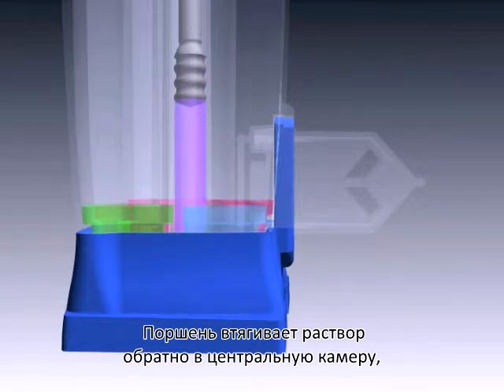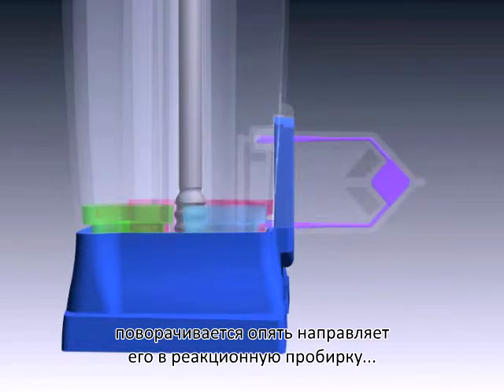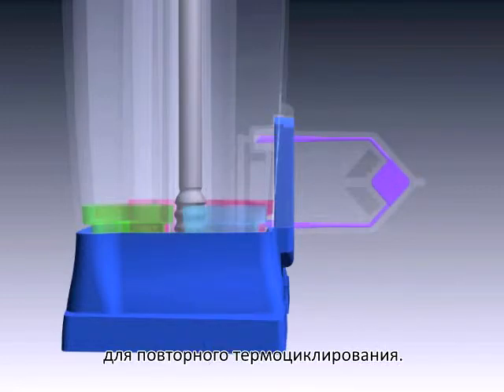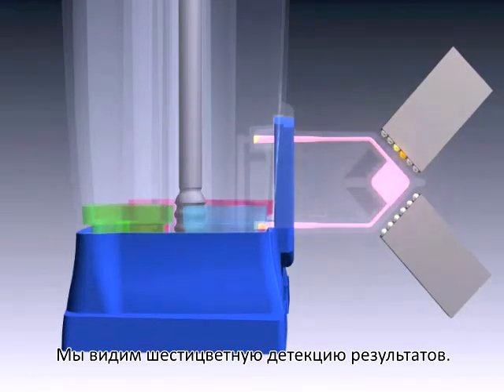The piston again draws the solution back to the central tube, rotates, and then dispenses the solution into the reaction chamber again for a second round of thermocycling. Here we show 6-color detection in process.